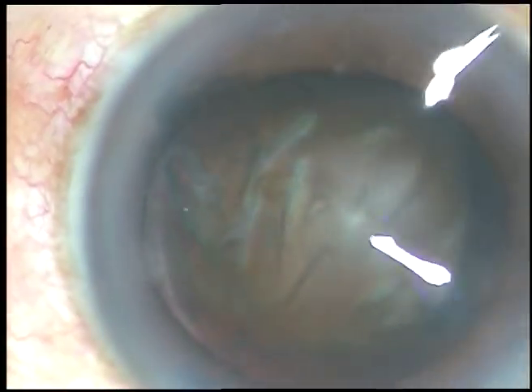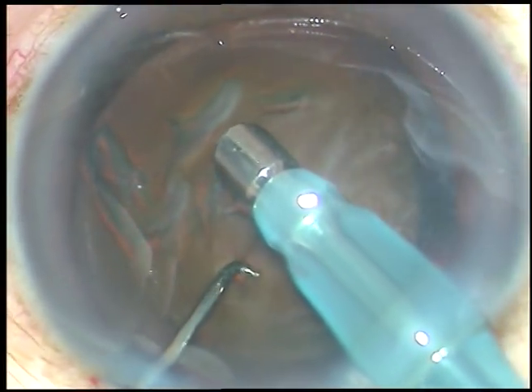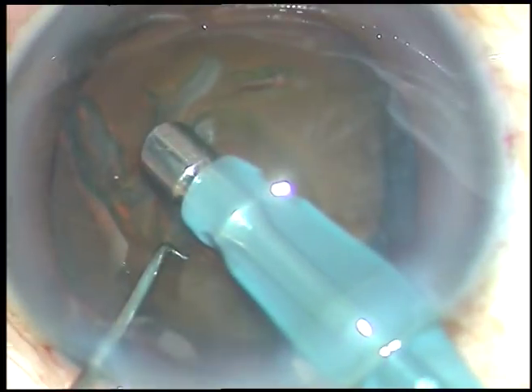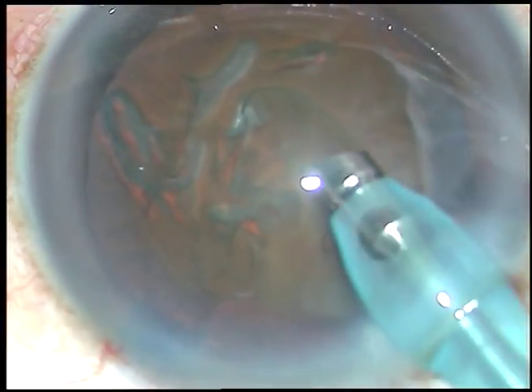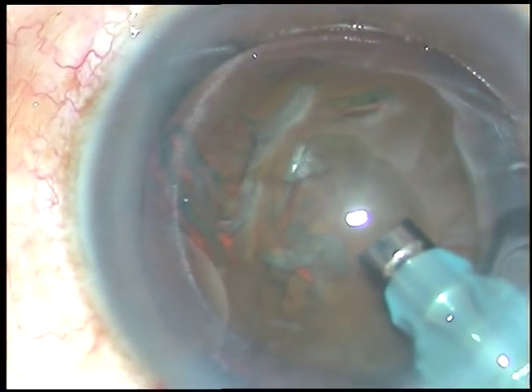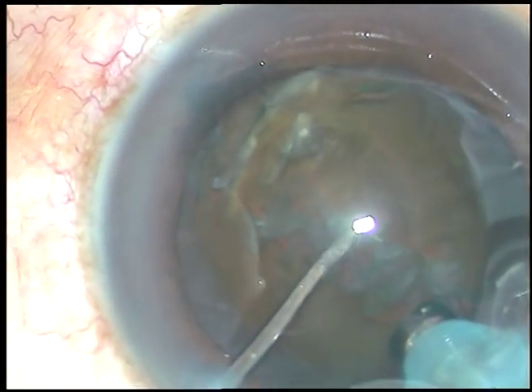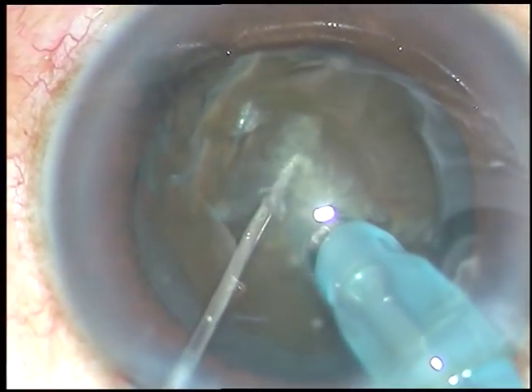Hydrodissection is done. And now the tip of the handpiece is being introduced into the anterior chamber. Some superficial cortical matter is removed. Now the handpiece is turned, bevel is made down, the nucleus is pushed a little down, and the tip is buried into the substance of the nucleus.